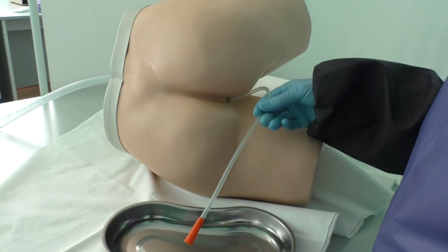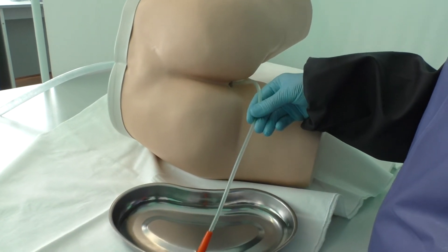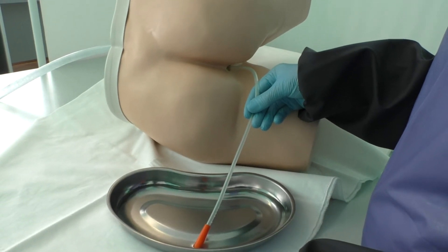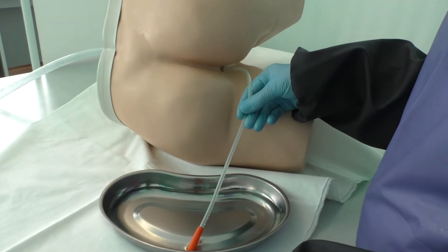Leave the rectal tube in place for approximately 30 minutes. Observe the expulsion of flatus and auscultate bowel sounds.